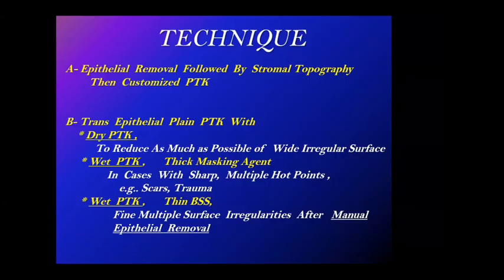When I said transepithelial, plain PTK, not customized, I said this before. So it is plain. All these types are plain. Now, why is the 55 micron plain? Because this is only topography guided. This is not wavefront guided.